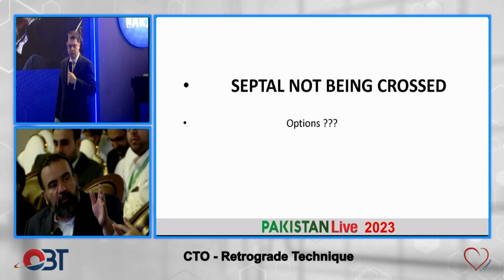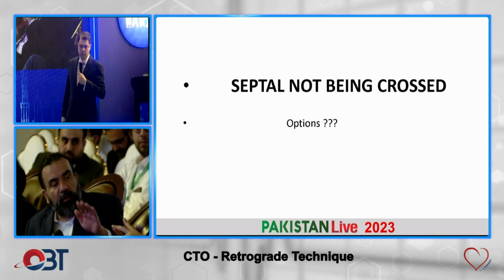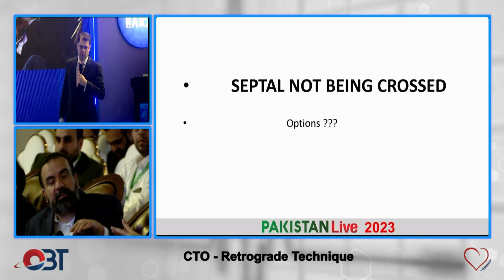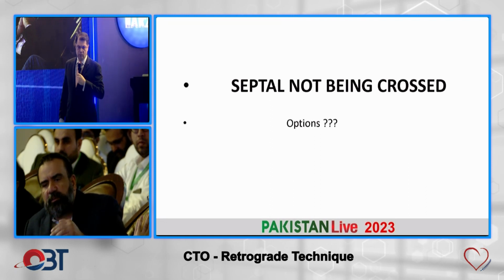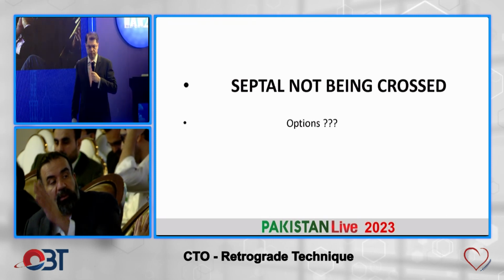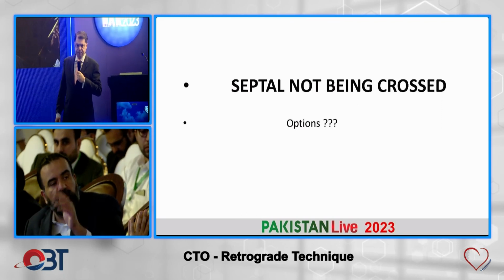But what you do is you take your pictures in the two views without panning, as they pointed out, and then I'll pause, and if I can't see it in the room, I'll go outside to the monitoring station and have someone do it back. Then I start going backwards, see where the PDA first lights up, and then slowly click backwards until I see which is the collateral, backtrack it to see where it's coming off. And that's a good way of identifying. And then sometimes if I'm doing the more distal ones, because they tend to be more angulated from the PDA, then I might do something like an RAO caudal view if I'm trying to get from the PDA to the LAD. But for the LAD coming down, typically I use a combination of LAO cranial and RAO cranial.